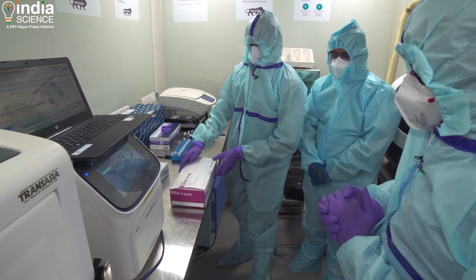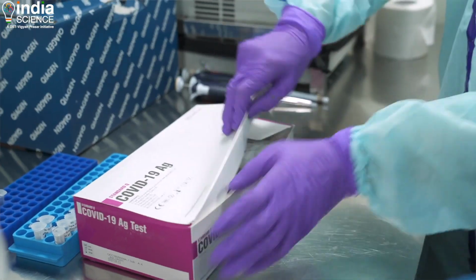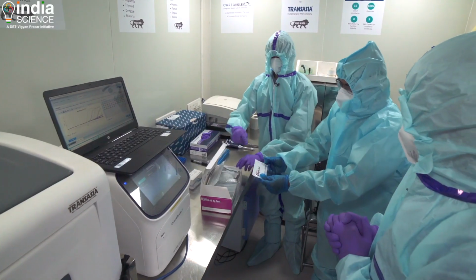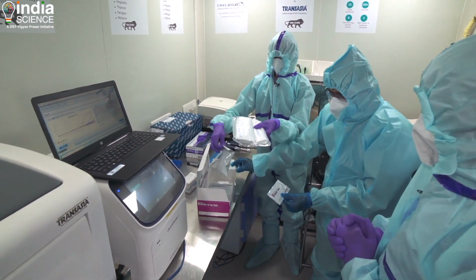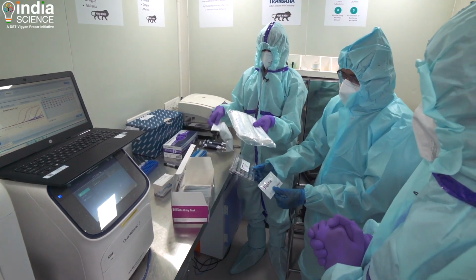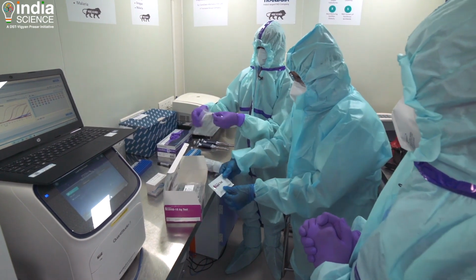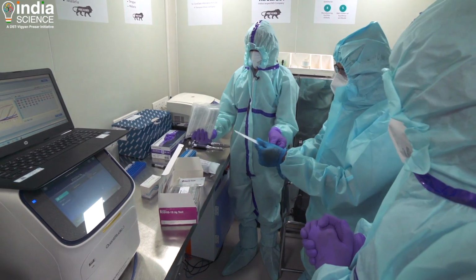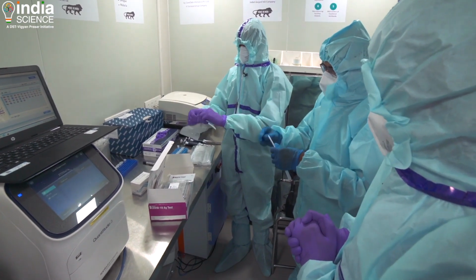Let's see what you do in this. Imran can show how this is done. The kit has a cartridge, a nasal swab, and the buffer, which is required for inactivation of the sample, and the nozzle and the small tube into which the sample is collected. So you open up one of the swabs, and you need your extraction buffer tubes.